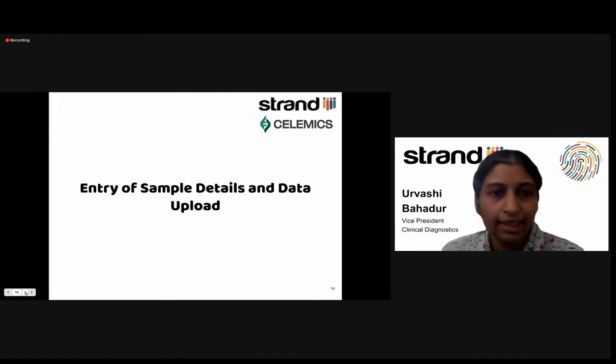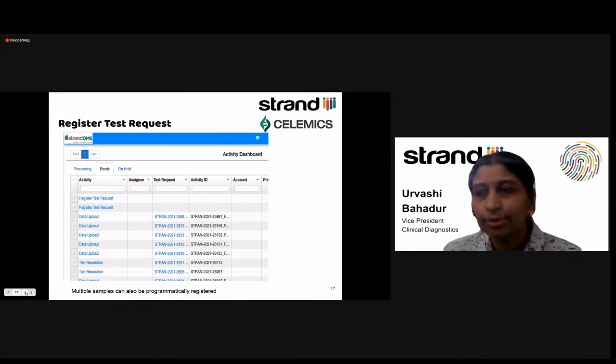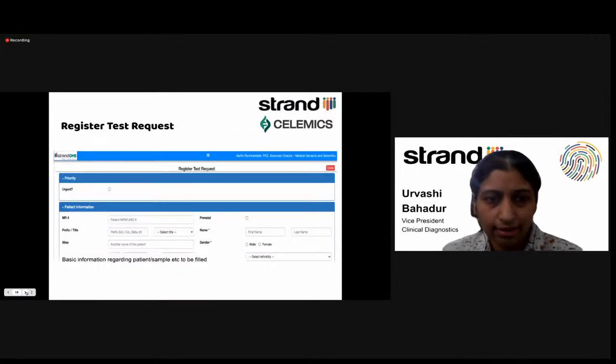So in the next slide, let us look at a snapshot of what the view looks like in StrandOmics for this. So you can see two activities here: register test request and data upload. Register test request is nothing but when you are creating an entry for a sample, and it's a quick process where you will actually put in the various things that are needed, such as the cancer type, the patient name and age if applicable, anything else that you require to be shown on the clinical report. So in the next slide, let's look at what that looks like here.